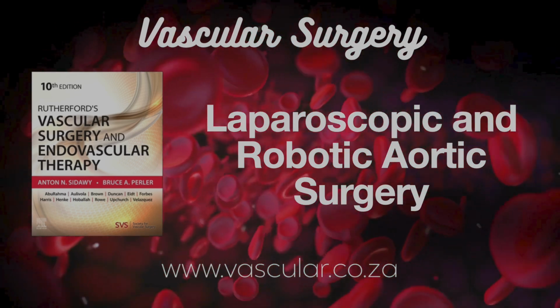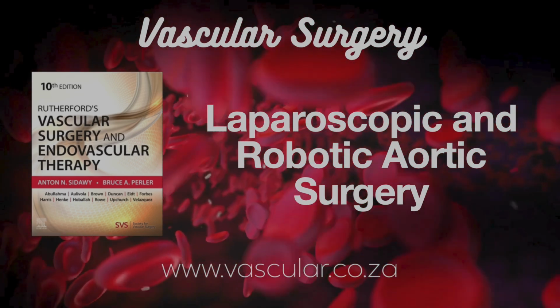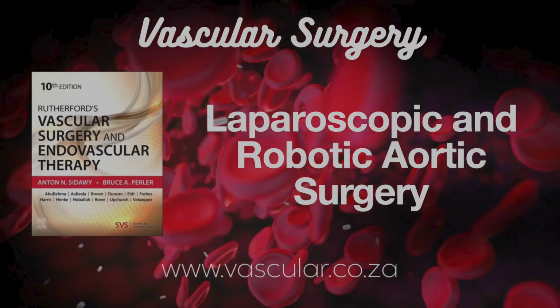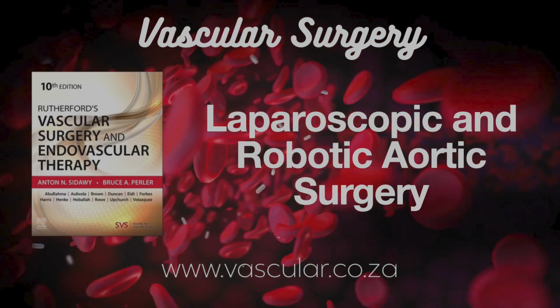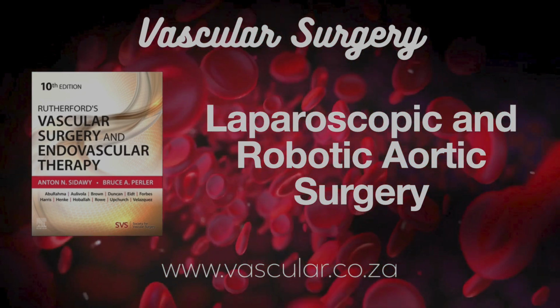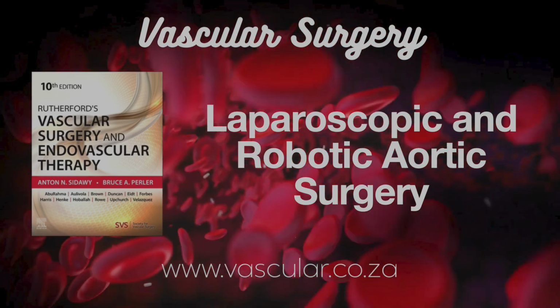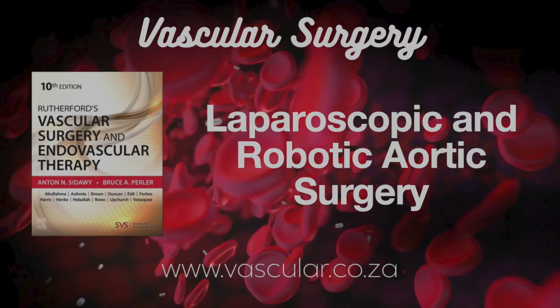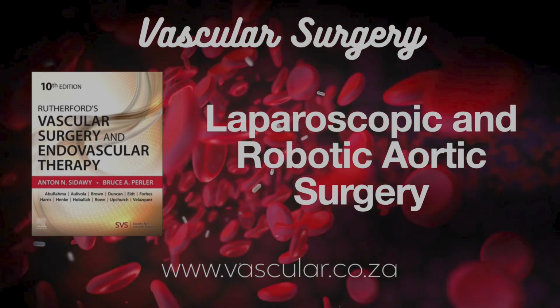Okay. Let's take the first one. The retrocolic prerenal transperitoneal approach. Wow, that's a bit technical. It is a bit of a mouthful. So this one, they often use it for blockages lower down in the iliacs, patients on their back. Maybe a little pillow under the left side, table tilted slightly right. Then they place the ports, the little entry points, in specific spots relative to the belly button and stuff. Yeah, exactly. Like xiphoid, umbilicus, iliac fossa.